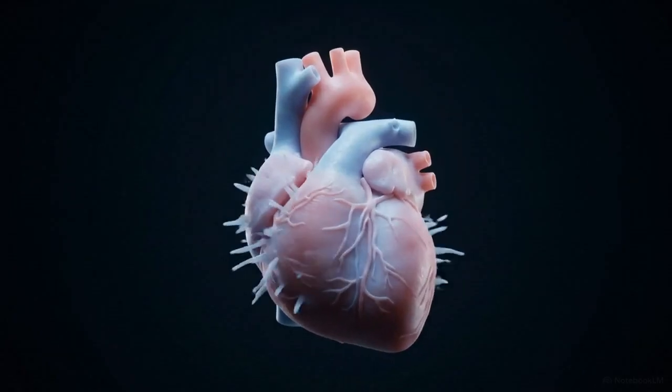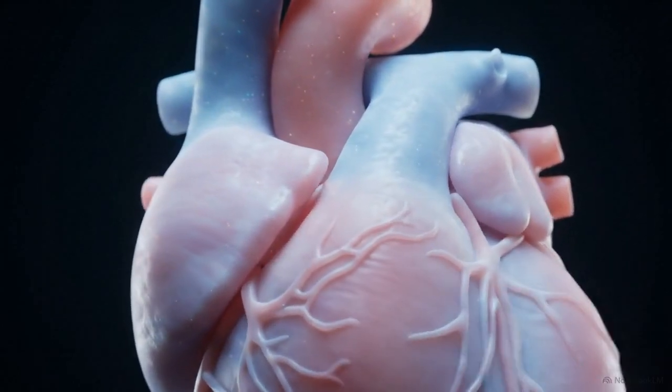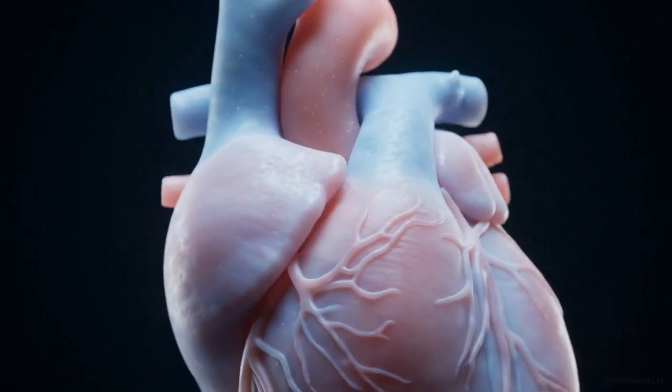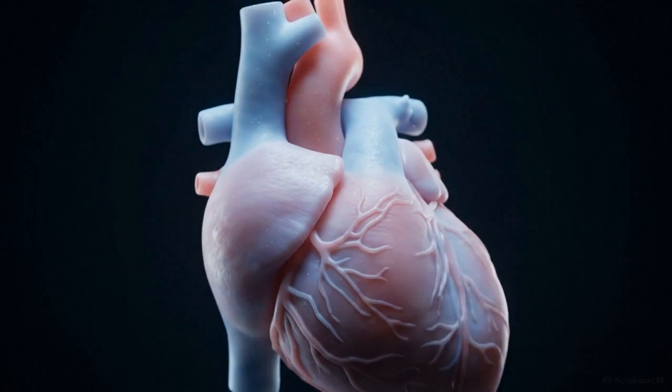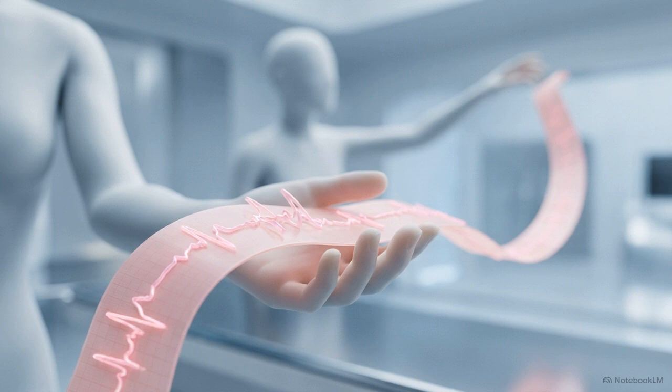Chaotic or irregular rhythms allow doctors to diagnose electrical failures, such as arrhythmias or dangerous electrolyte imbalances that interfere with cellular depolarization. By tracking the timing and shape of the electrical current, the ECG serves as a frontline triage tool capable of pinpointing the nature of a cardiac failure.